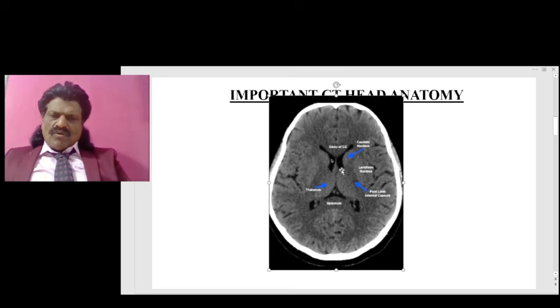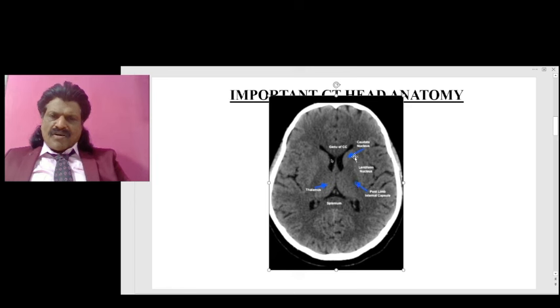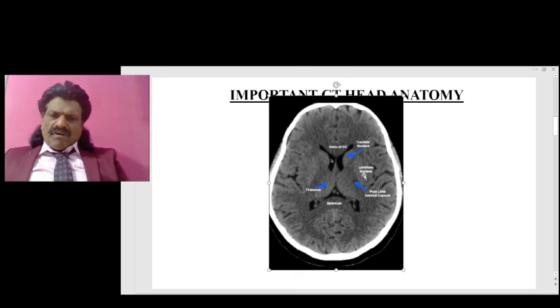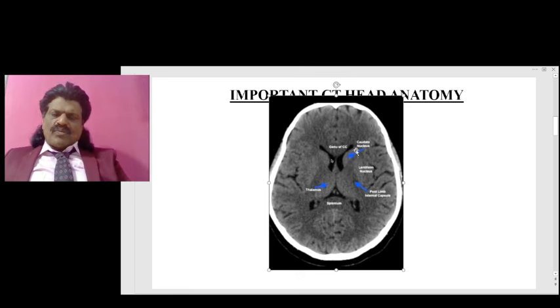Now we are talking about the most important anatomical landmark of the head: the internal capsule. This dark area is the internal capsule — very important. This is the anterior limb of the internal capsule, this is the genu, and this is the posterior limb. This is the area where all the important tracts are present — the corticospinal tract and the sensory tracts — and in the genu we have the corticobulbar tract. The anterior limb carries the Papez circuit and the frontoponto cerebellar fibers.